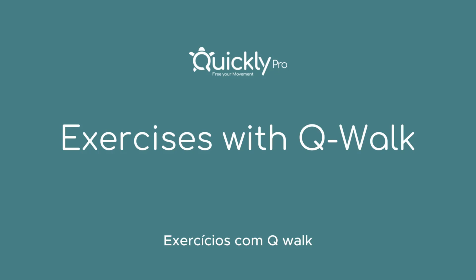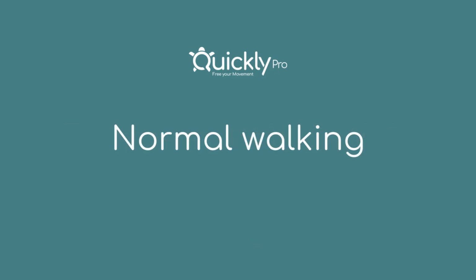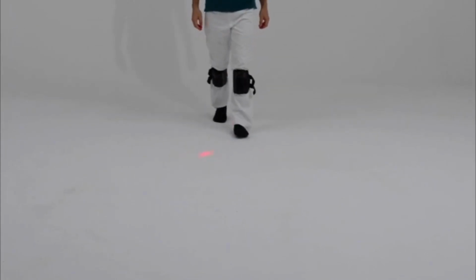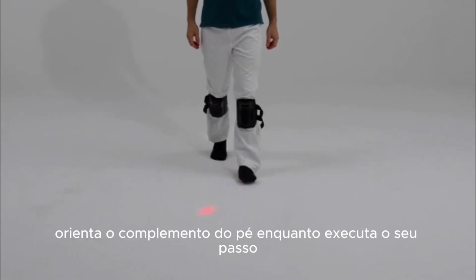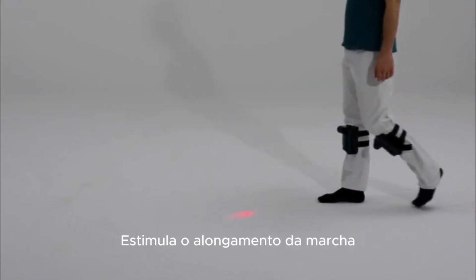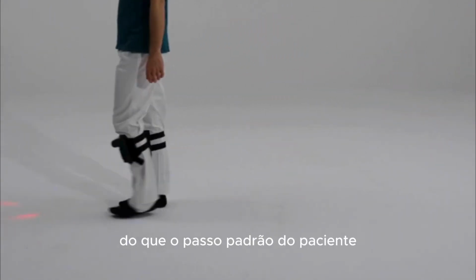Exercises with Q walk. Normal walking. Typical gait training with the use of Q walk. Visual feedback guides the foot placement as you perform your step. Stimulates gait lengthening when the projection is set farther away than the patient's standard stride.